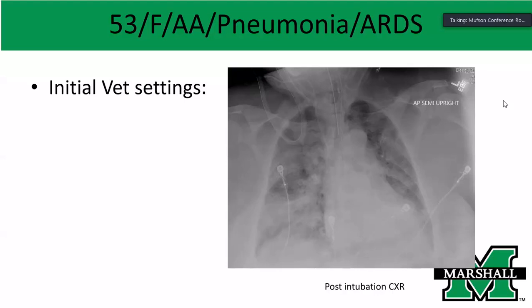Okay. What mode of ventilation do you want to choose? So we can start with assist control, volume control mode. Okay, so you want a volume controlled mechanical ventilation. Okay, and then you said the FiO2 is 100, right? Appropriately, you just intubated a very sick patient. The PEEP, you said what? We can start with 10.